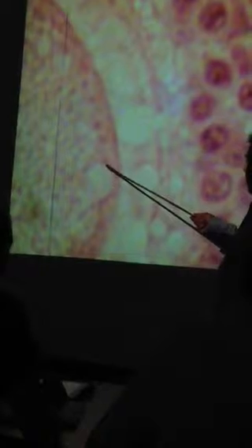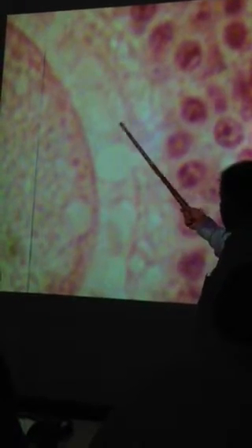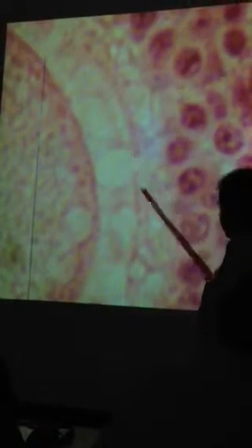This is a high mag of the ovum. Now, you'll say, that looks like the lens of the eye. But we're not doing eyes, right? But anyway, that's the ovum. Then here's the zona pellucida right here, from about here to here. You don't see any cells in here, do you? And then once you get out here, this is the what? Corona radiata.